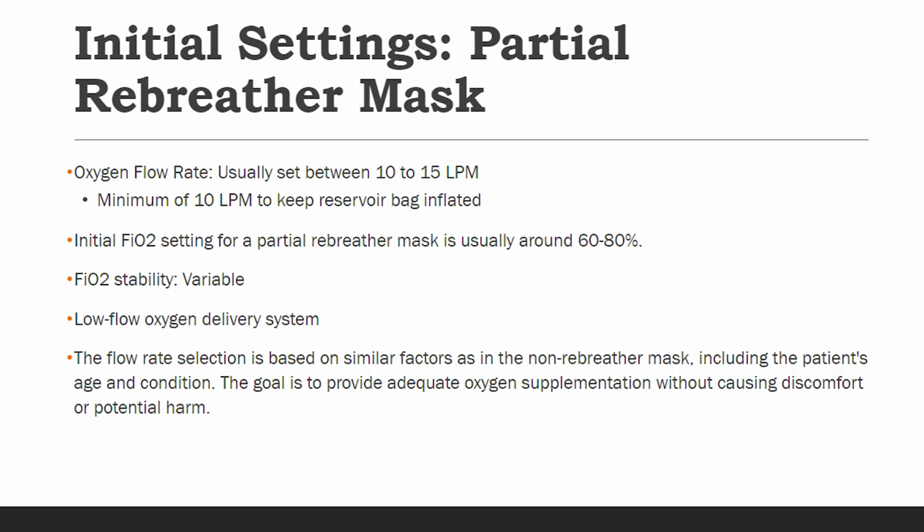Now that we've discussed the initial settings for the partial rebreather mask, let's take a brief pause and allow my classmate to provide you with a quick review of both the non-rebreather and partial rebreather masks.